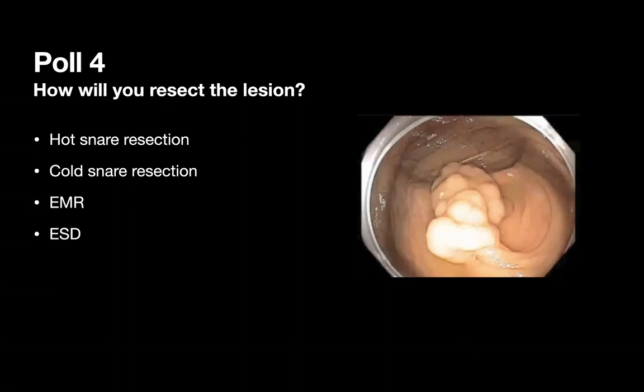And of course, I think that a lesion of 2.5 centimeters can be removed in the same session if he does not have many more additional lesions. So that's my opinion. Same session, if possible. Okay. Sriram.